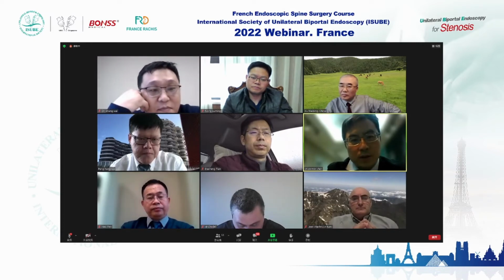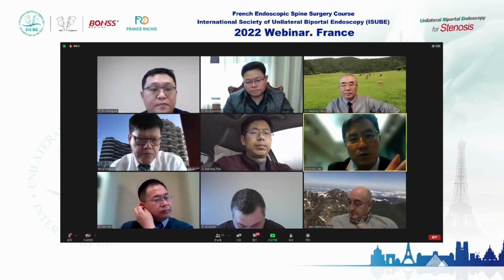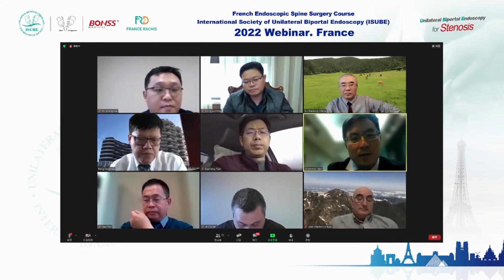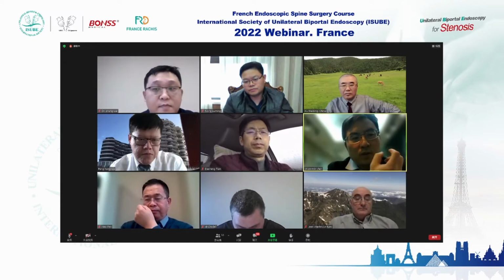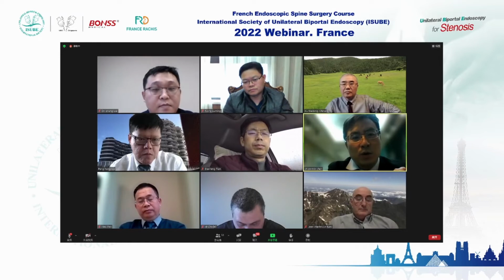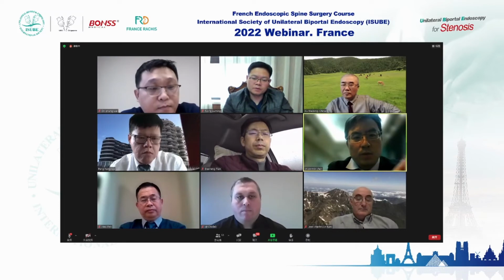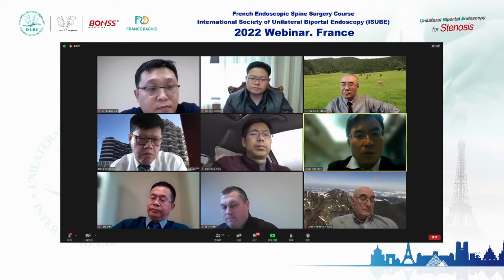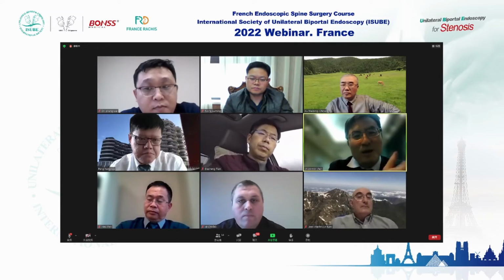The second problem is that outside the lamina, you can use the largest instrument. There is no problem. But inside the spinal canal, especially in the cervical spine, you need to use a small one. I'm not sure whether biportal has small instruments. Sometimes in uniportal, I published using the retrocorporeal approach. That is a very small endoscope, inside, and maybe a slight touch of the spinal cord. So I think maybe uniportal is better than biportal. This is my opinion. I'm not sure.